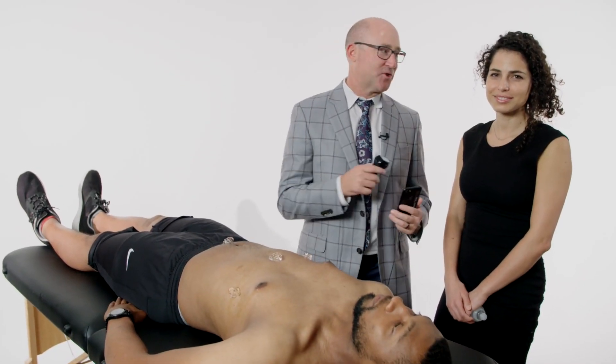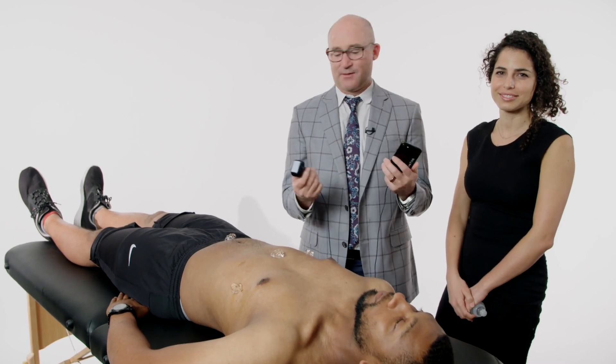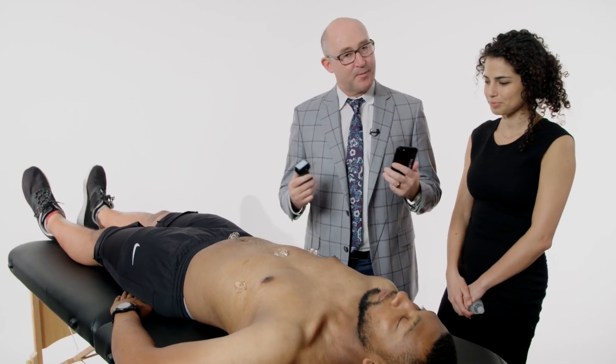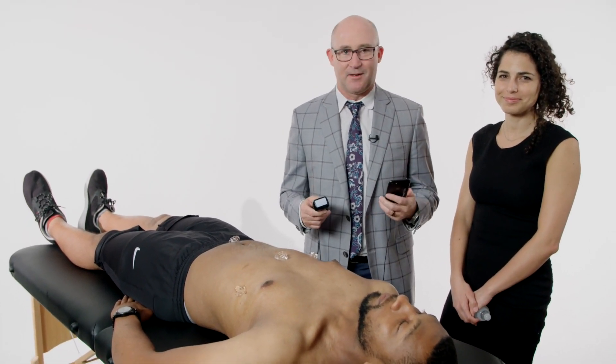My name is Dr. Chris Fox, and this is Dr. Chanel Fischetti, and I would like to show you guys this Butterfly ultrasound. A lot of people ask me: is this thing real? Can it really be three transducers in one? Is this some kind of gimmicky thing?